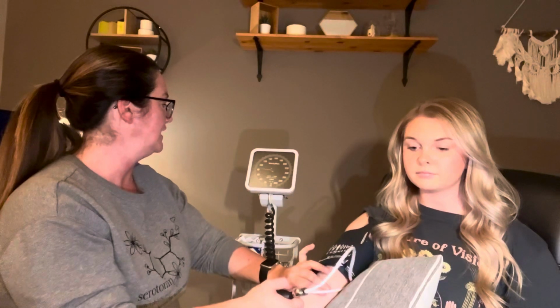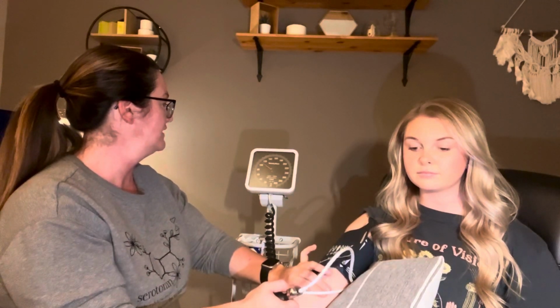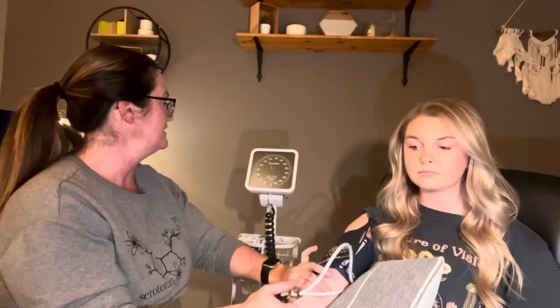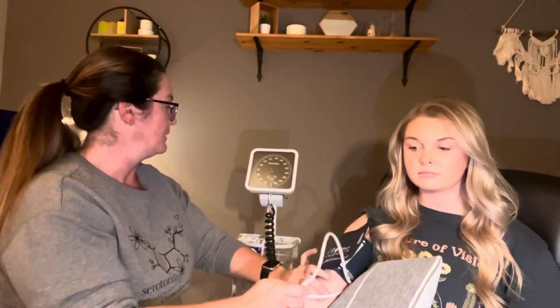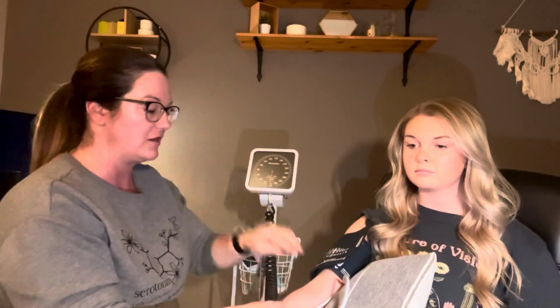So feeling, I can still feel it. Okay, I can't feel it there. So at 116, I'm gonna go to 146 to make sure it stays obliterated, and it does. I'm gonna bleed the cuff off. So the reason we're doing this is to obtain a baseline. That should be around what her systolic number is.